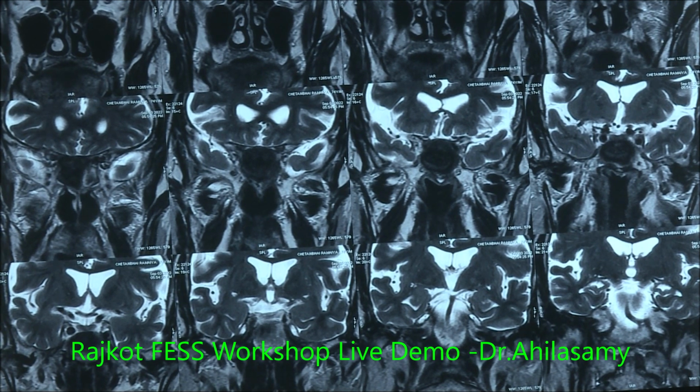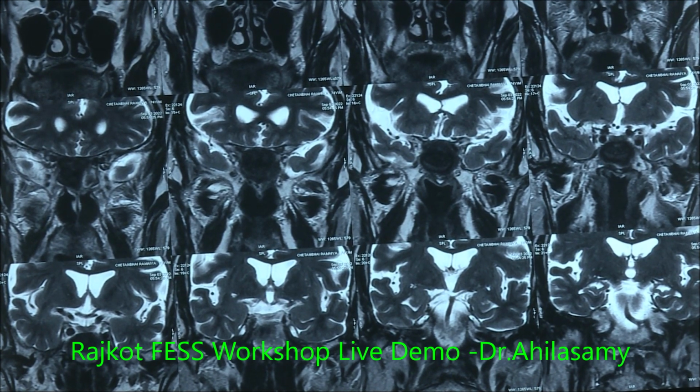Yesterday we had a similar case, but this is a fungal ball. I feel let's go in and see what it is. Sometimes the pictures look like even a pituitary mass, but it is a sphenoid mass.